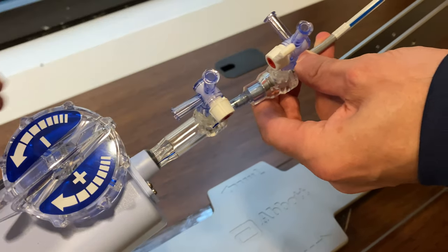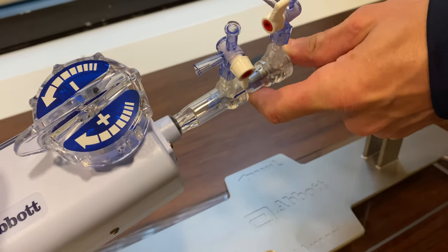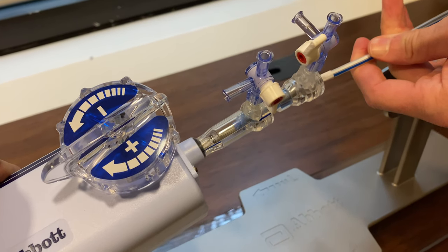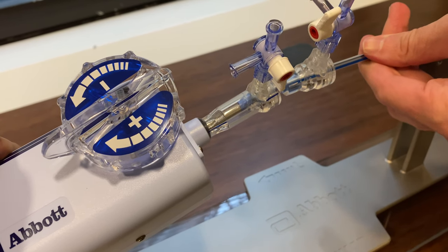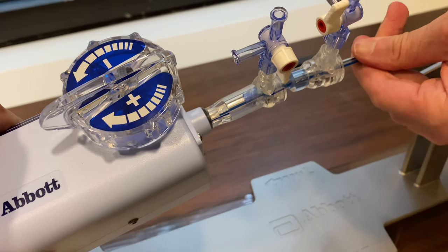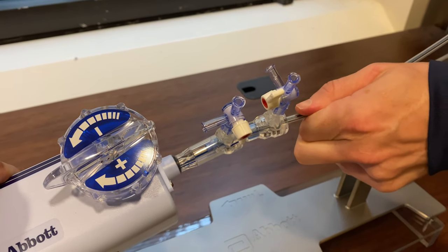You can see now the clip is inserted with the initial sheath, and you can see that the clip is being introduced into the guide. You'll see that there's blue to blue, as we call it, to confirm that it's keyed properly, and you should be able to see that the clip is advanced without any resistance.